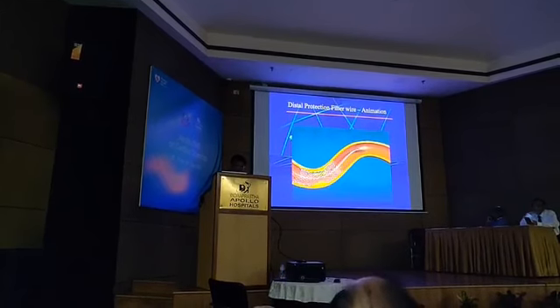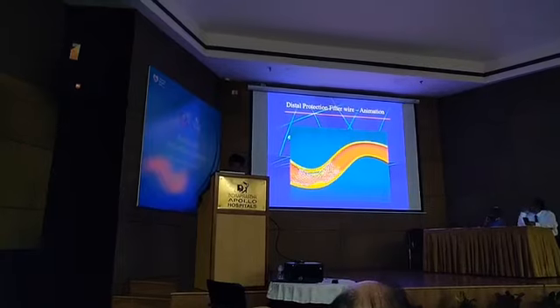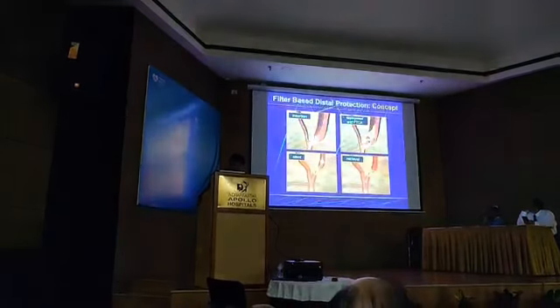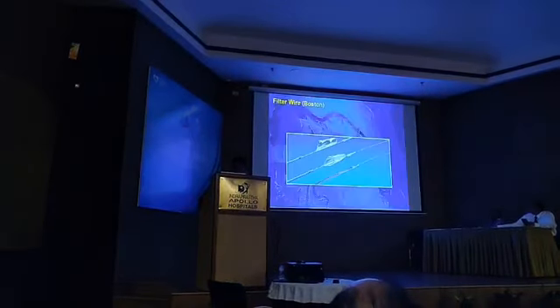Removal of the filter wire, and this is the procedure which is complete. This is how the small animation shows the filter-based distal protection. The concept has been shown, various types, not going into details.